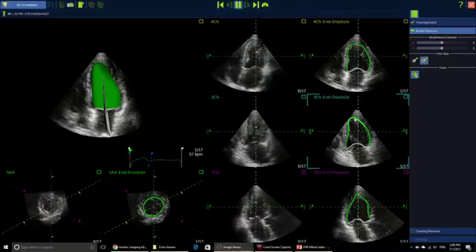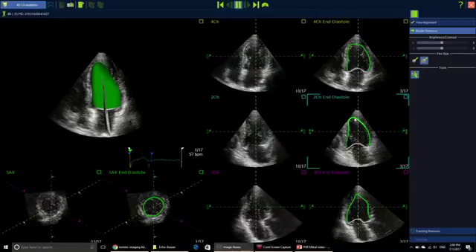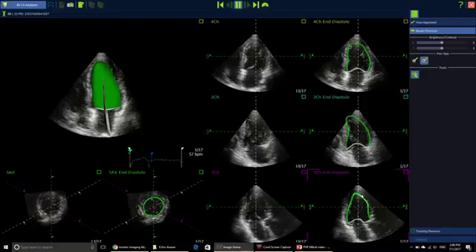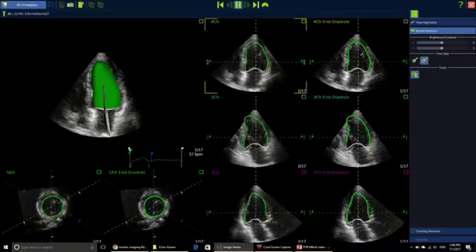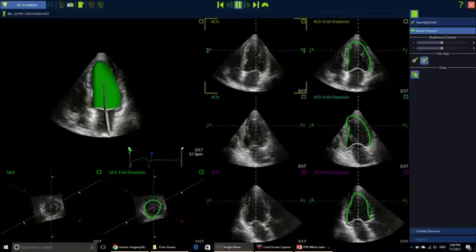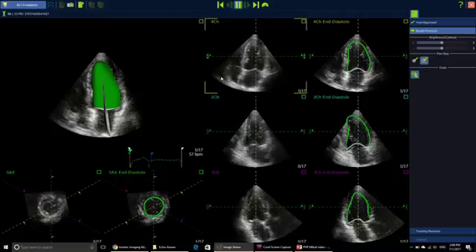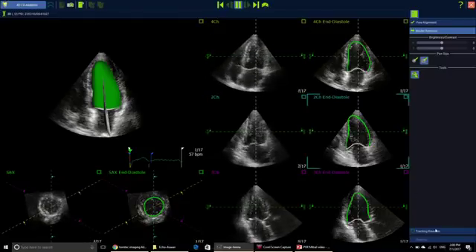It is very user-friendly. You can edit in the long-axis views and also in the short axis if you need to. If you need a different level of the short axis, you can just pull this down or push it up — it will give you the short axis at a different level, and then you can edit. If you are happy with that, you can click on 'Tracking Revision.'